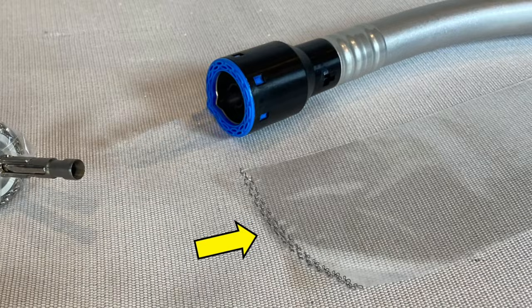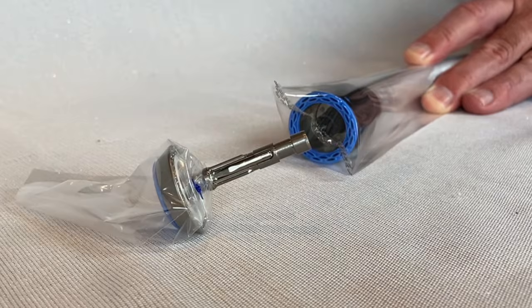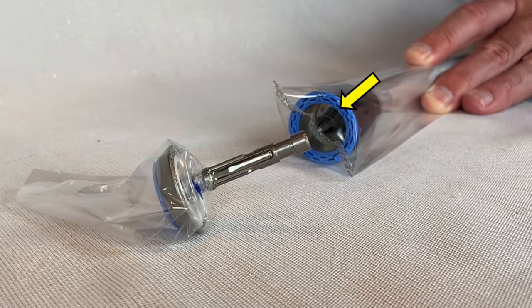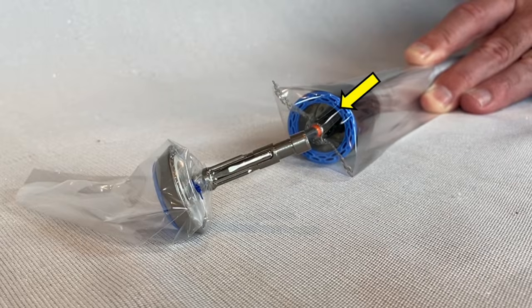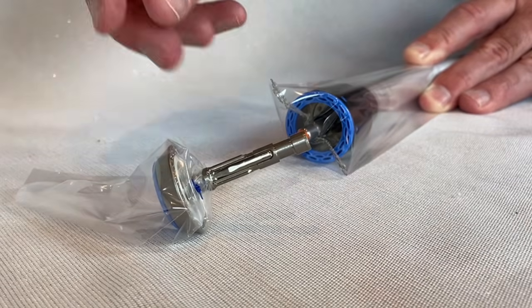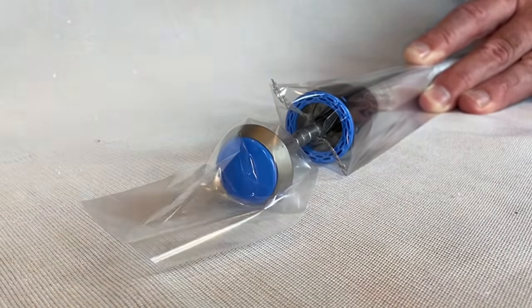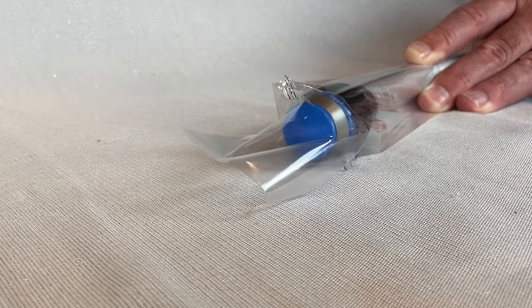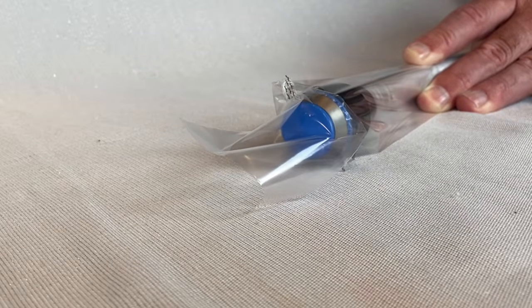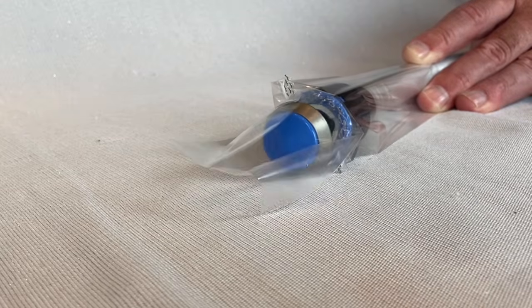Now let's go over to the other end of our bag, and this simulates the rectum, and I'm going to place the stapler up into this bag, and once it's inside, I'm going to open up the spike by turning the dial at the end of the stapler. This is going to open up, and then I'm going to take the anvil, attach it, and then turning this dial in the opposite direction, it's going to close it back down again. Once it's closed, I'm going to pull the trigger, fire the stapler. This is going to seal the bowel ends and then poke a hole in the middle.